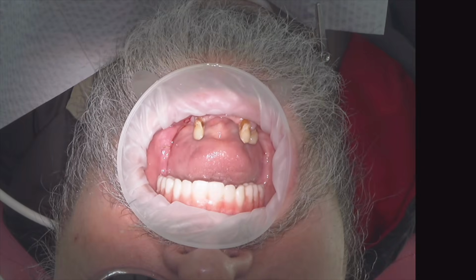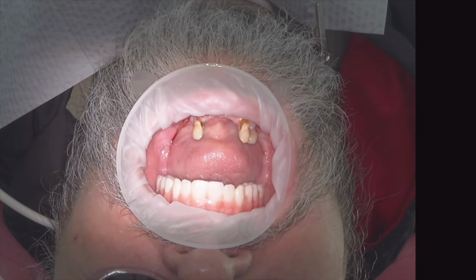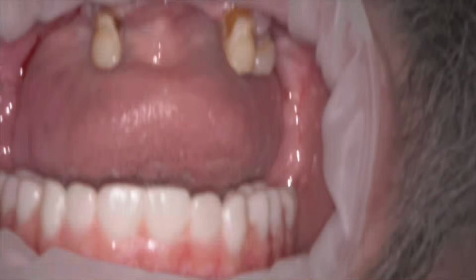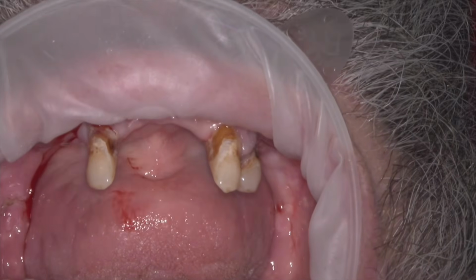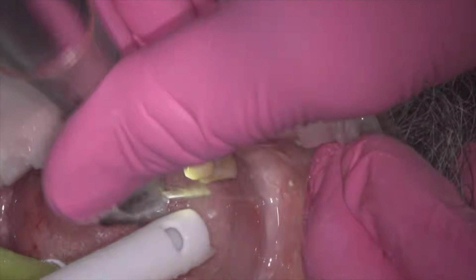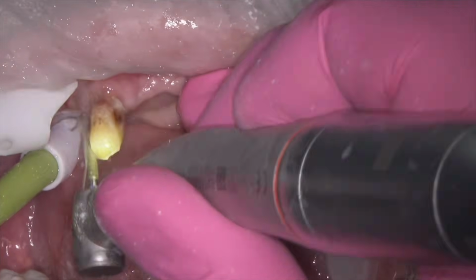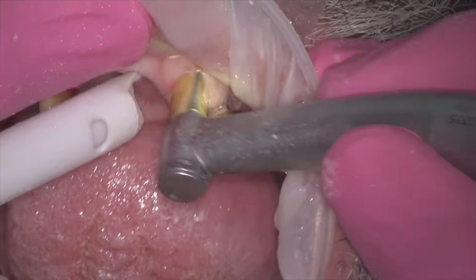So I did the preps. Now these are just super fast preps, because I didn't have a lot of time here. I think that I just spent about 25 minutes on these preps in total, including the decay removal and core buildups. And so they're not the world's most insta-worthy preps.